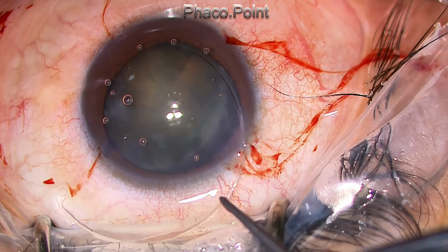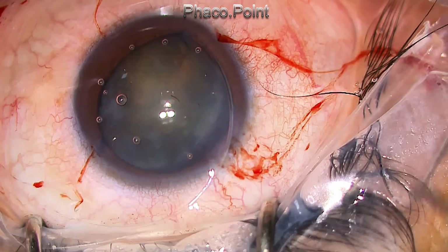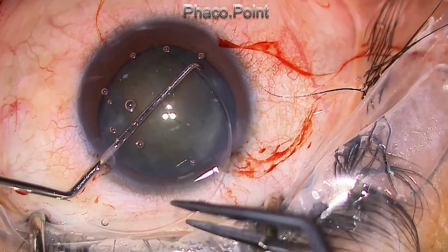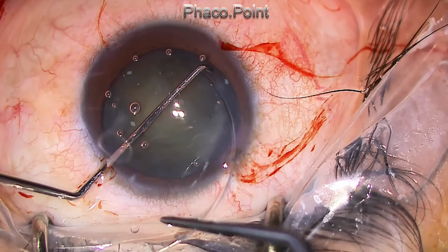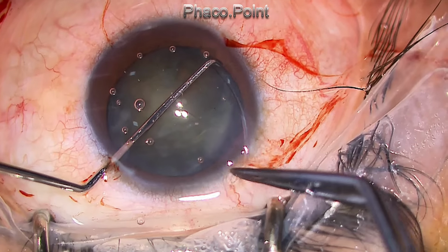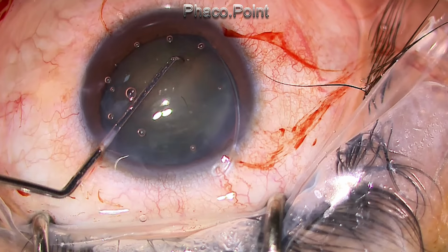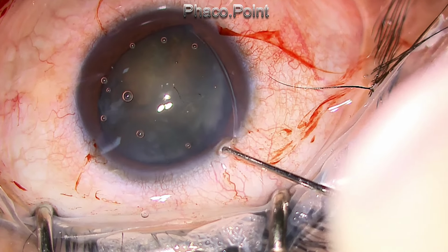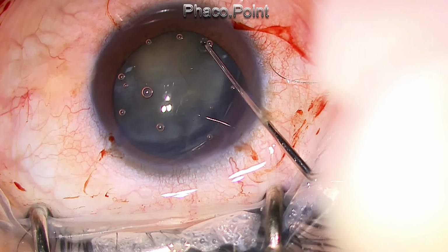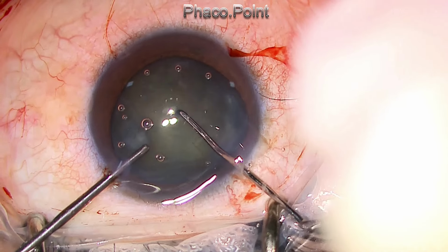Well, this can be done by gently advancing the CTR in a stepwise fashion, using a Sinskey hook from the side port to support the portion of the CTR that goes behind the rhexis, because we don't want a stretch of the rhexis at this point, which can lead to a tear. And you can see that it is quite easy, because this is just a grade 1 nuclear sclerotic cataract. It's quite easy to thread the CTR in. And once you've got the CTR in position, we know that this CTR is going to create a nice equatorial stretch of the capsular bag, and that's going to give me enough support.